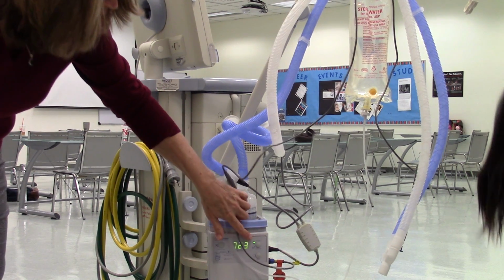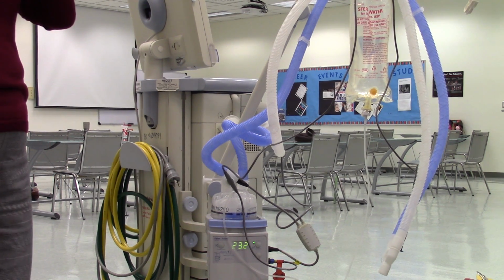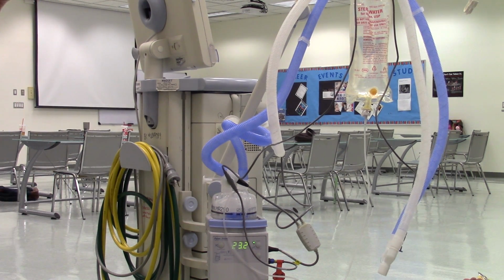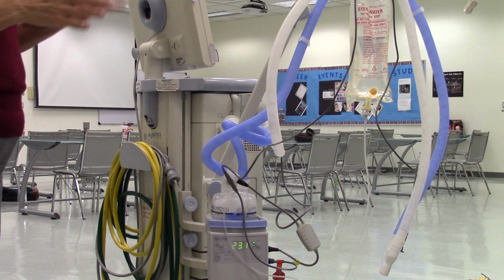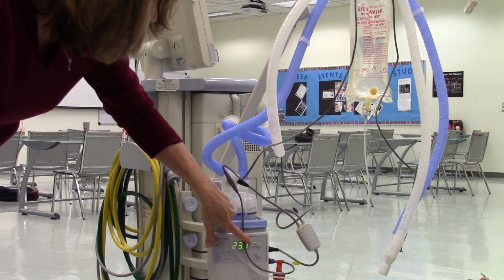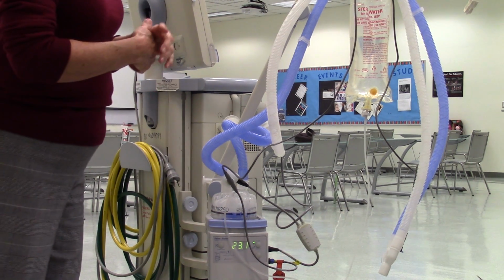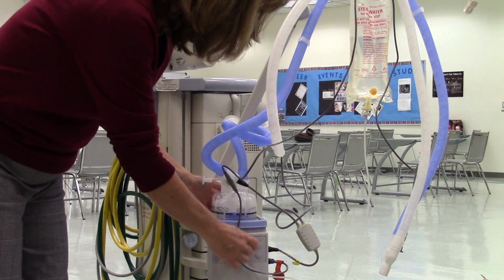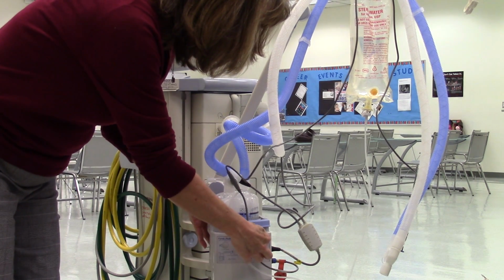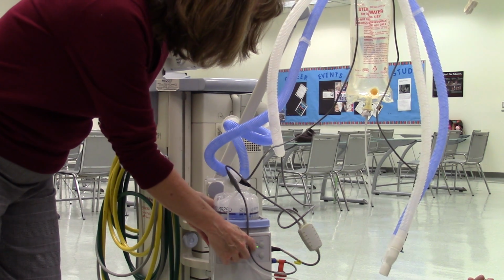on the top right, you see a picture. One of them shows a picture of an endotube, and the other one shows a picture of a mask. So we want to set this up like we're ventilating a patient with an endotube. So we want it to show in the invasive setting, and it already does. Right. But let me just show you how to change it in case you have to change it to non-invasive. You just press it and hold it until it beeps, and then it'll go to the next one.